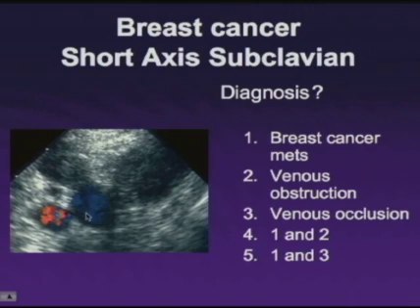And this other structure here is not the subclavian vein, but instead is a large collateral which mimics the subclavian vein. And as we scan in different planes, we realize that it no longer follows the subclavian artery, but goes off in an entirely different direction. So remember, one view is not adequate enough to make sure that we're looking at normal vessels, and you really want to show that the entire vein is running in normal orientation.